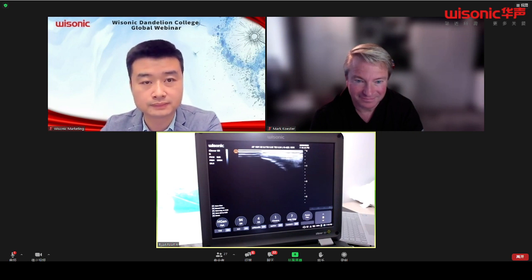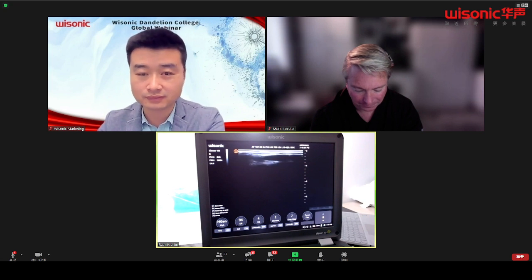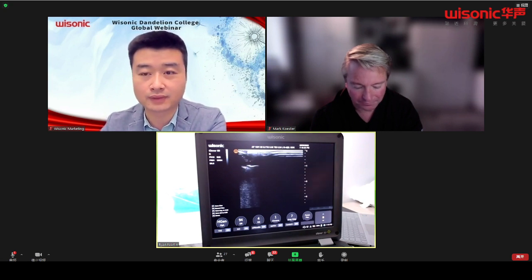And I'm sorry to hear that, but you're in the right place. We'll get that fixed. All right, so that is that medial joint line. Again, there's a lot of other things that we could do. There's a lot of other scans that are available.